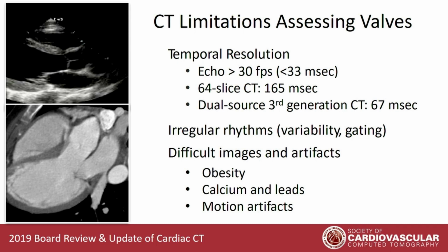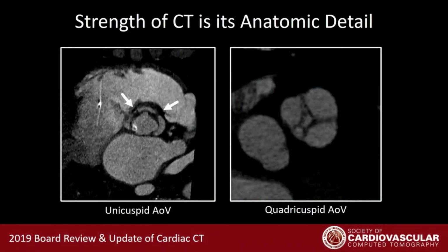Also metallic leads, again, hard to beat CT in terms of identifying that they're there, but metallic leads, particularly moving metallic leads, can cause artifacts, and we'll talk about that as we go. Motion artifacts we've already talked about. So there are limitations for CT, and yet the exquisite anatomic detail that's available with CT really makes it a good technique, at least a good adjunct technique, for the evaluation of cardiac valvular disease.